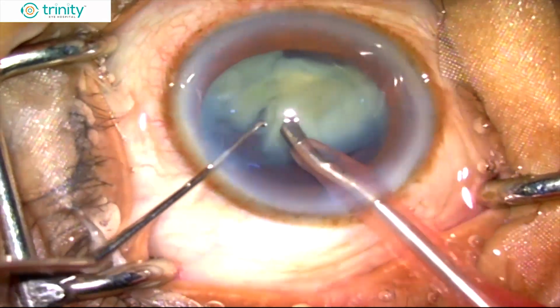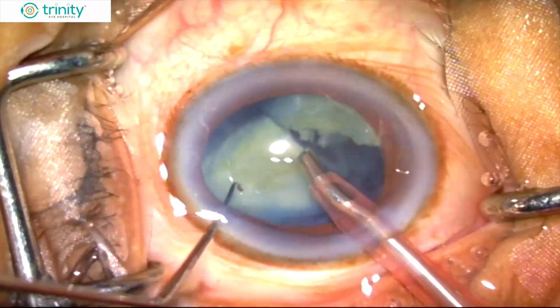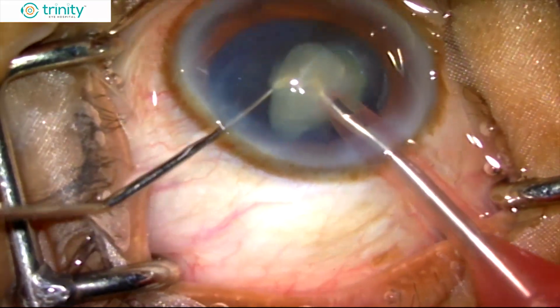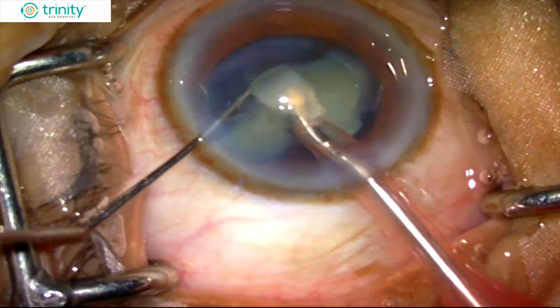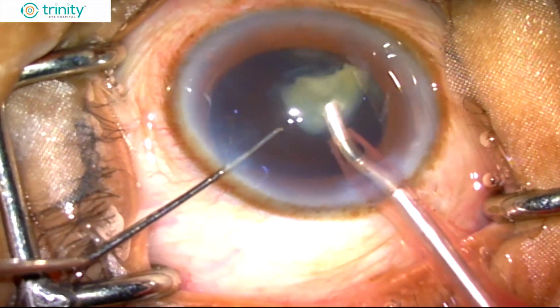Now when you reach towards the last pieces, it's very tricky because you know very well that there is no epinuclear plate supporting the posterior capsule. So you have to be very careful, reduce the parameters to the minimum and slowly complete the phaco.